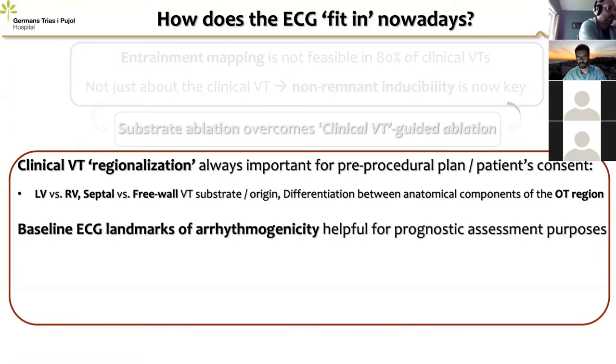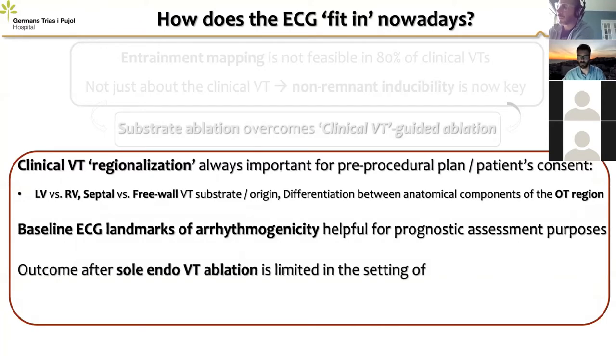We can also take a look at the baseline EKG, because many times we will have a sense of the arrhythmogenicity and therefore the refractoriness to ablation that the patient we are going to put on the table is going to have. So by this means, we're going to have a prognostic assessment of this patient.